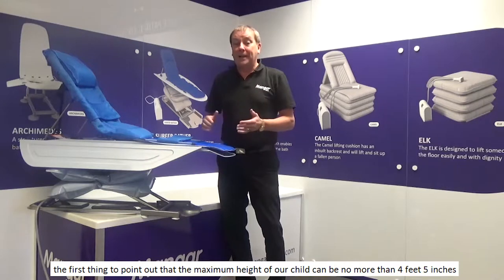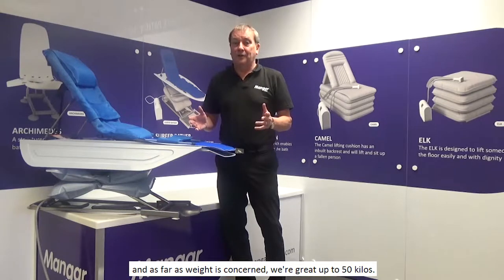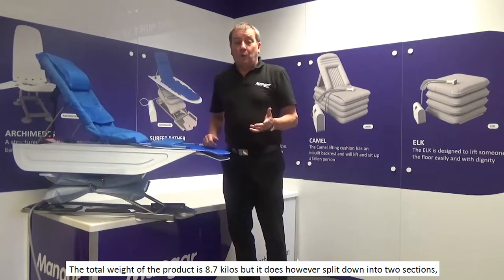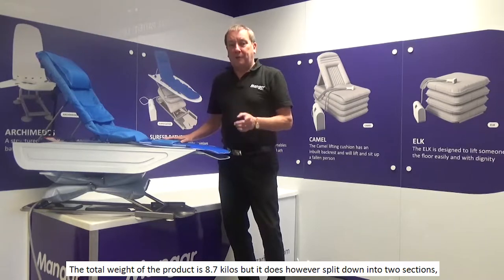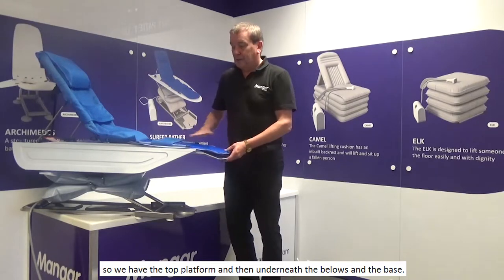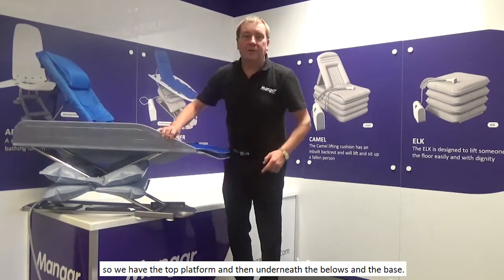The maximum height of the child can be no more than 4 feet 5 inches, and as far as weight is concerned we're great up to 50 kilos. The total weight of the product is 8.7 kilos, but it does split down into two sections: the top platform, and underneath the bellows and the base.